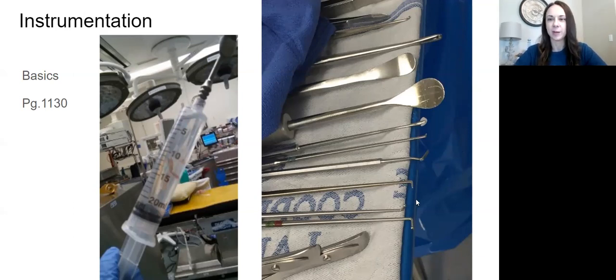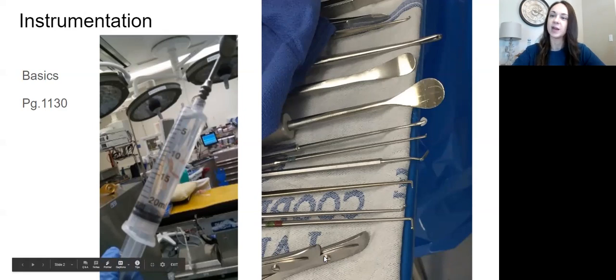So I want to go through a couple here. Just by glancing, I can tell what these are. So these two right here are two different rongeurs. I can tell by the handles. We're going to have lots of rongeurs to bite big pieces of bone during both types of neurosurgery cases. Right here, I've got two different, it looks like nerve hooks, especially this big one. They're gonna use these nerve hooks for a lot of different things. It's not always to hook around a nerve. So I just wanted to point that out. It's used for other things.